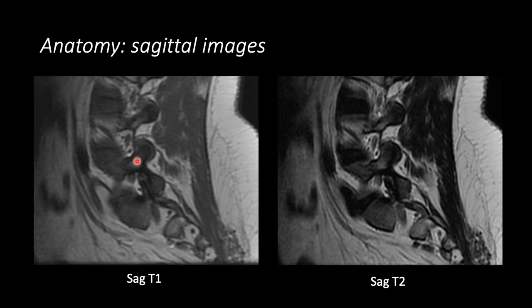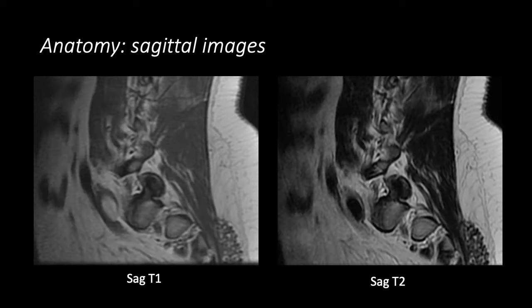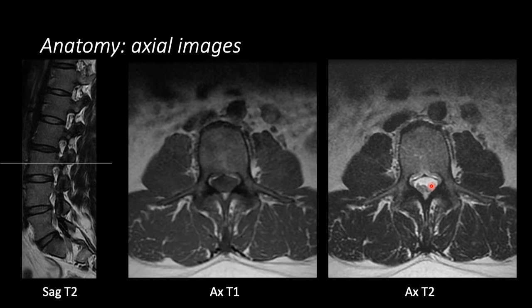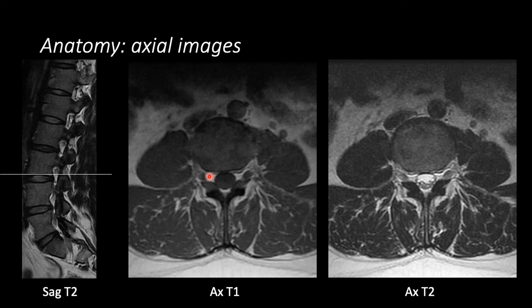This is the pedicle of L5, the superior articular process of L5, and the inferior articular process of L5. On the axial images, as we scroll down, we can see the thecal sac — this ovoid dark area surrounded by epidural fat. On the axial T2-weighted images, we can see the nerve roots within the thecal sac. Here we are at the pedicle level. As we go a little bit lower, we end up in the neural foramen and can see the nerve roots exiting on either side.